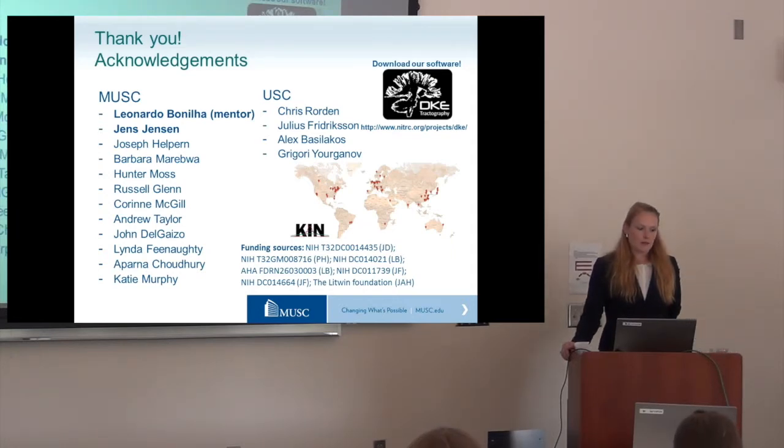Yeah, so let me repeat the question. We did have 2 baseline and 2 post-treatment scans. How similar were the tractography? So what we did in this study is actually use the same tractography for all 4 time points because we wanted to focus on changes in microstructure along the tracts, rather than changes in tracts themselves that maybe could have been caused by the methodology and not necessarily by the treatment.